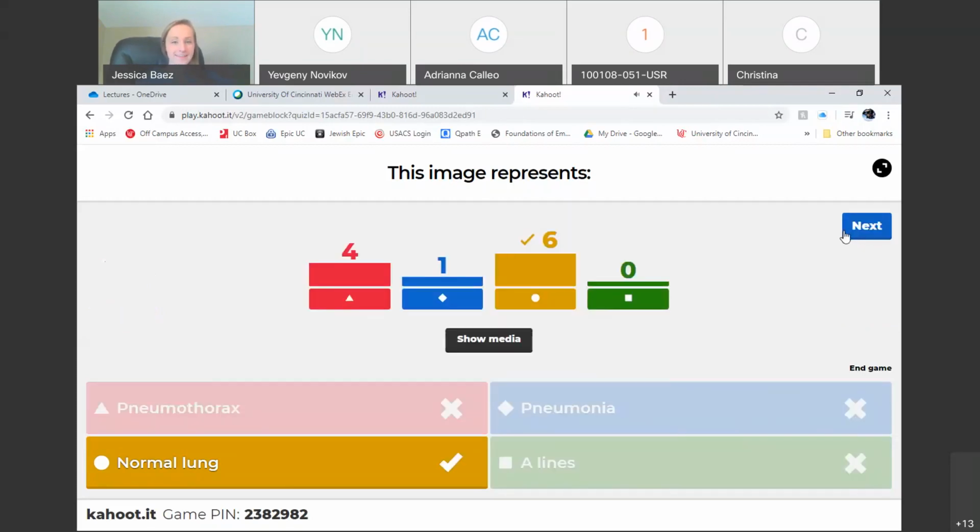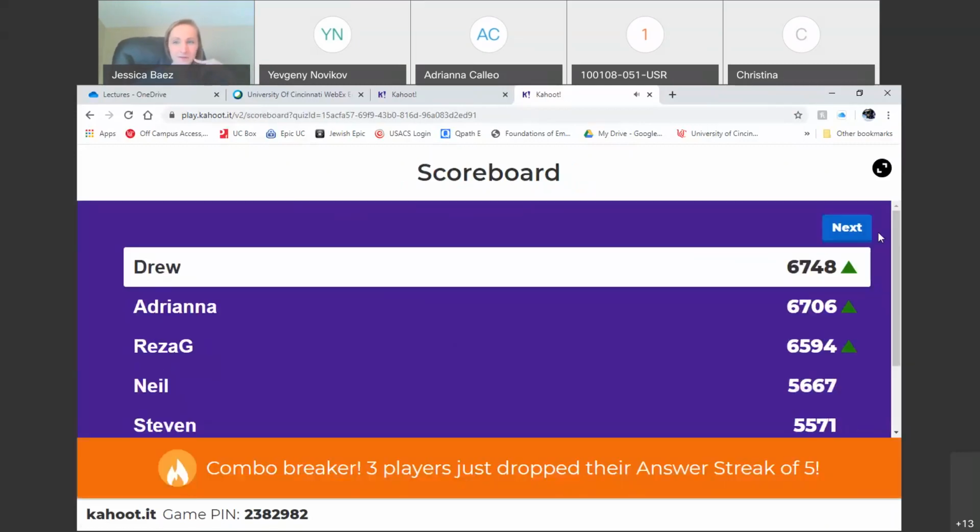All right. So that was the seashore sign. So it's important to pay attention to the near field and the far field and see if they look similar. Pictures are a little bit hard, obviously, on this game, so no worries. But that was the seashore sign, which means it is normal lung sliding, whereas pneumothorax would have been the barcode. And typically, M mode is not actually helpful with pneumonia. Ooh, we got a new leader. All right.